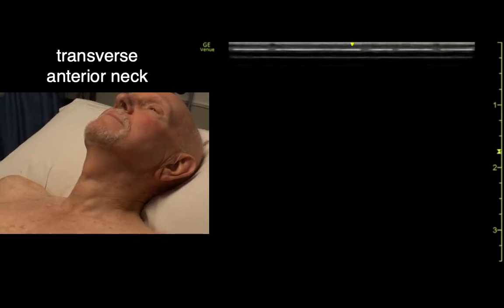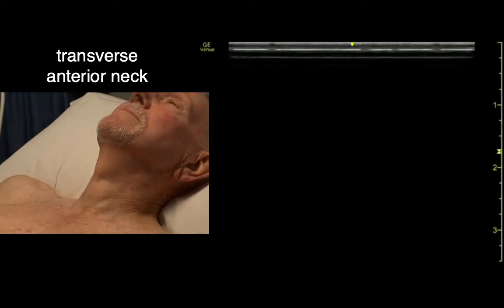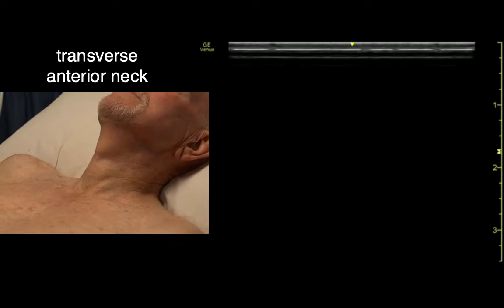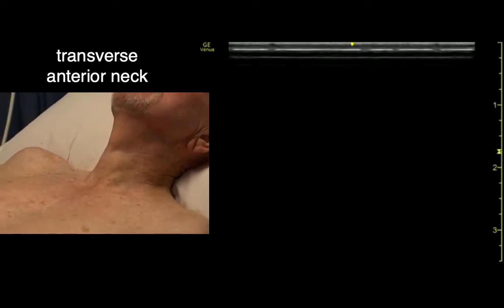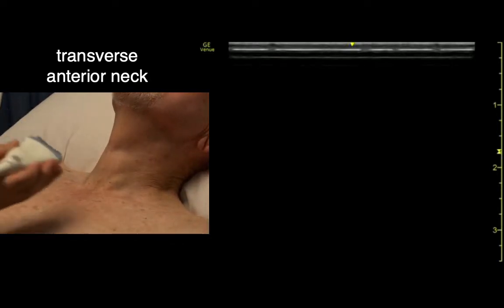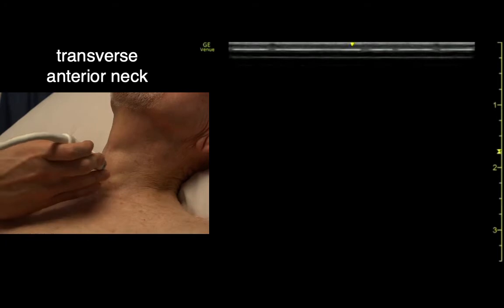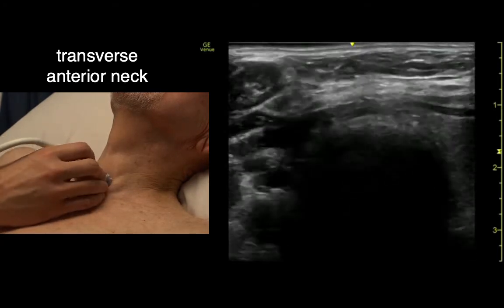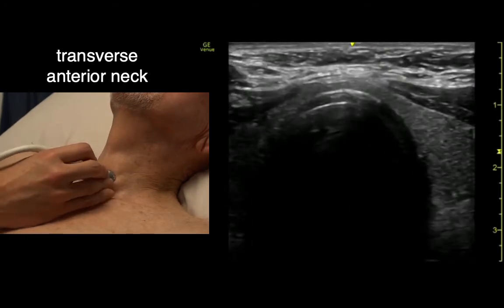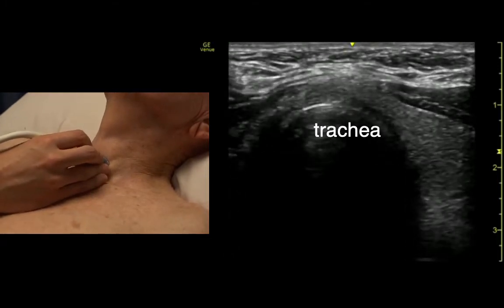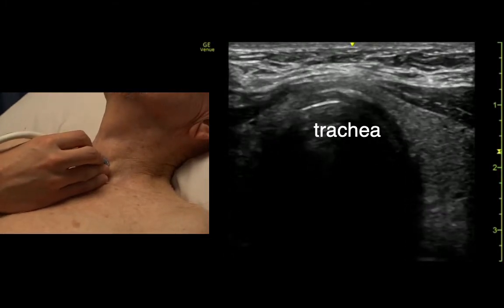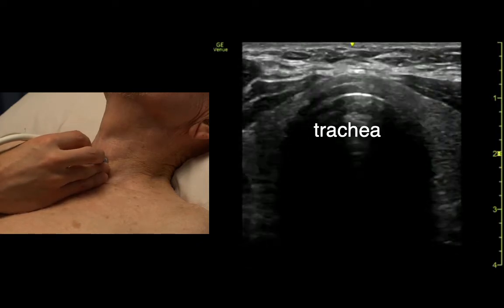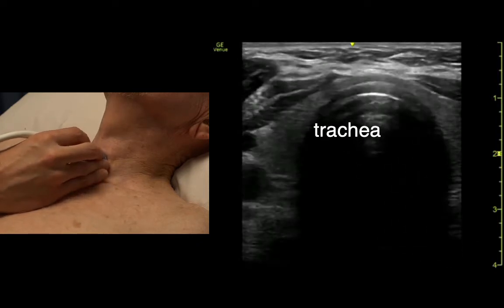We're going to look at a couple of simple basic things in the head and neck. We'll start with identifying the trachea — we might look at this when confirming ET tube placement. Just transverse right on the trachea. The trachea is full of air, so it looks like a ring with reverberation and shadows behind it.